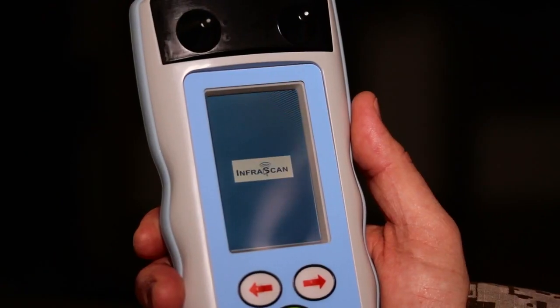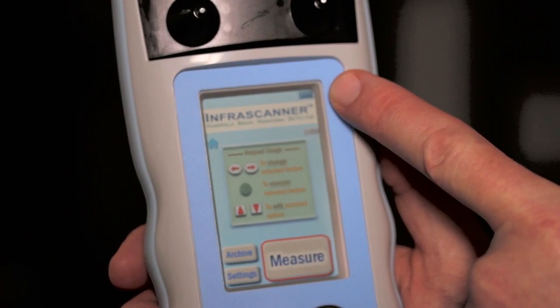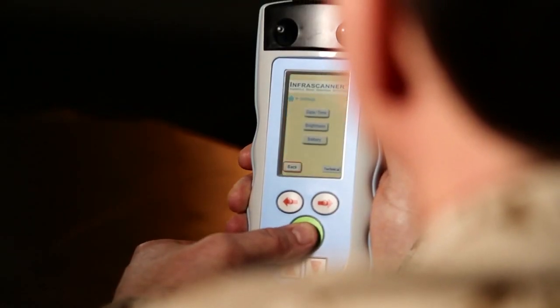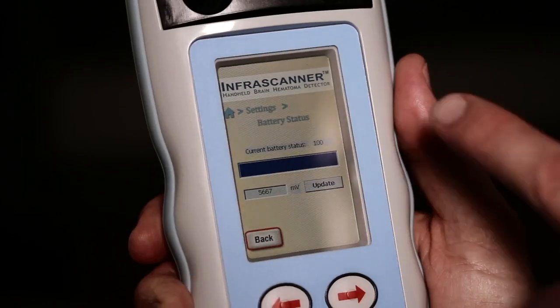The first thing you want to do is make sure the system is fully charged or has fresh double-A batteries. The system provides an hour and a half on rechargeable batteries and up to two hours with double-A batteries. The battery indicator light is located in the top right of the screen. If you see a low battery indicator, you have approximately one to five scans remaining. You can also navigate to the settings screen, which will give you the percentage of battery life remaining.